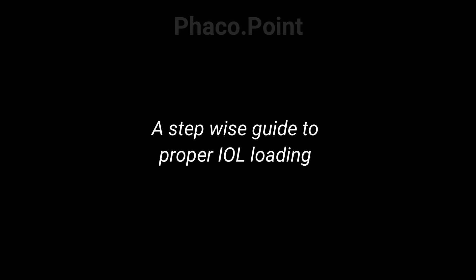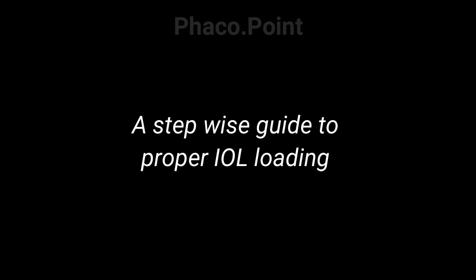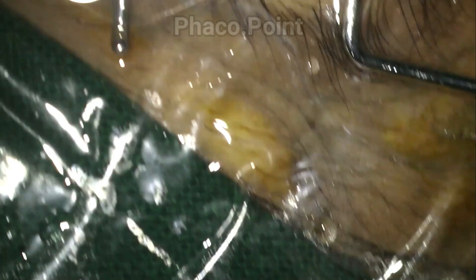What if there were a maneuver that each of us could consistently perform to safely deliver the IOL into the capsular bag each and every time? Let's look at the following video. The capsular bag is insufflated with viscoelastic at the end of the surgery, and now the loading of the IOL begins.